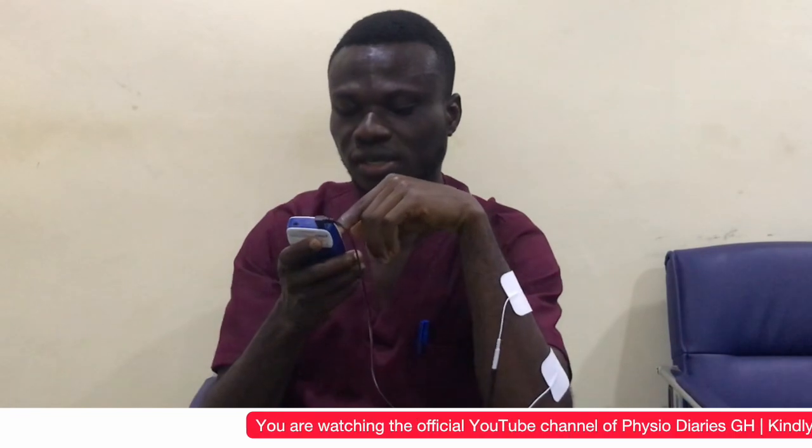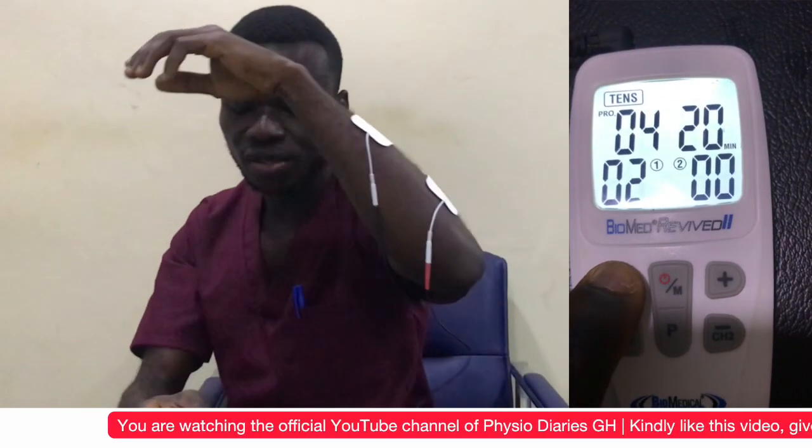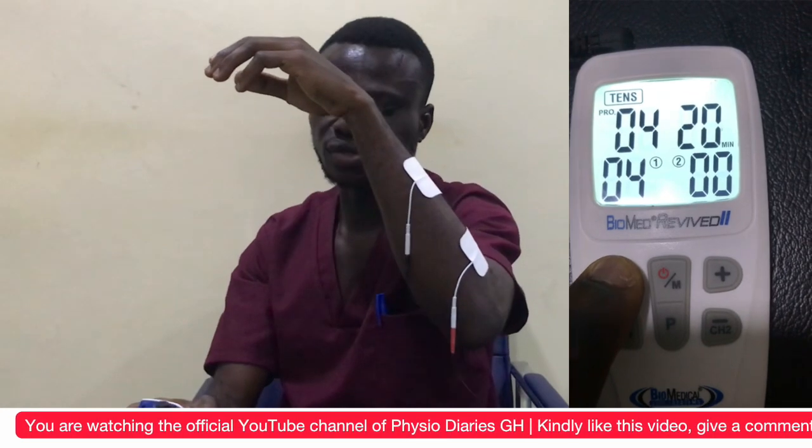It comes with a duration of 20, but I will not stick to 20 — I'll stick to 15 minutes for the treatment. When I'm done setting, I begin to increase the intensity.